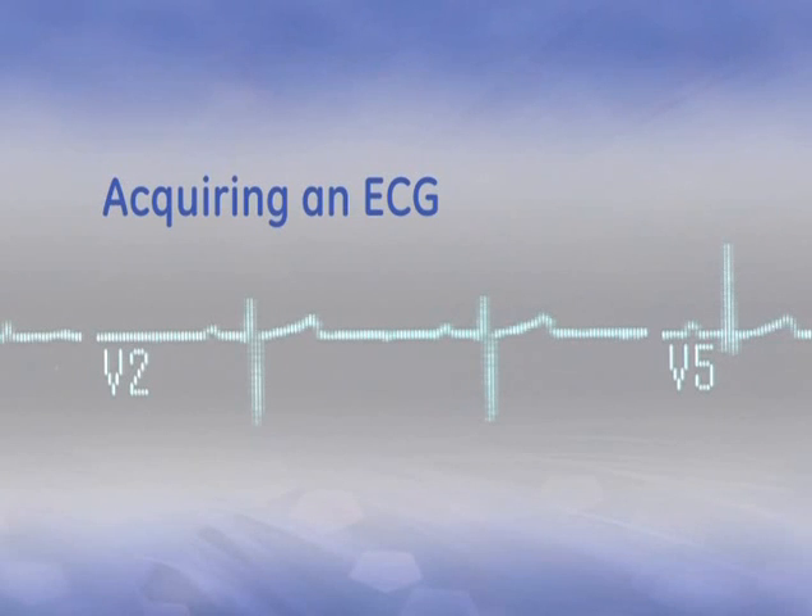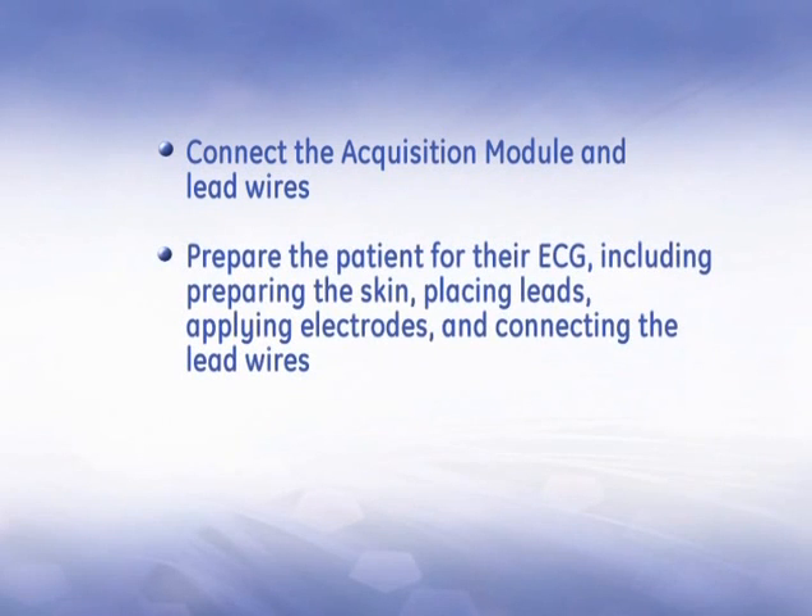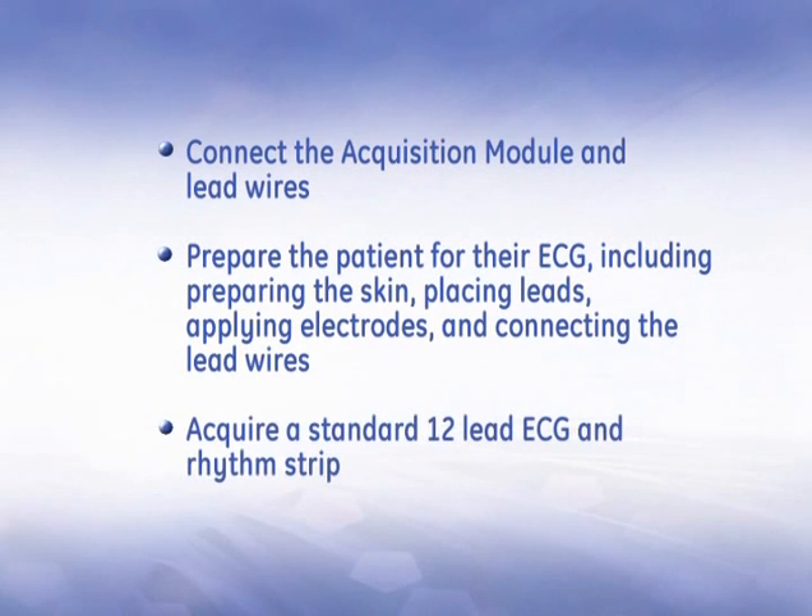You are now ready to acquire an ECG. In this section, you will learn how to connect the acquisition module and lead wires, prepare the patient for their ECG including properly preparing the skin, placing leads, applying electrodes, and connecting the lead wires, and acquire a standard 12-lead ECG and a rhythm strip.